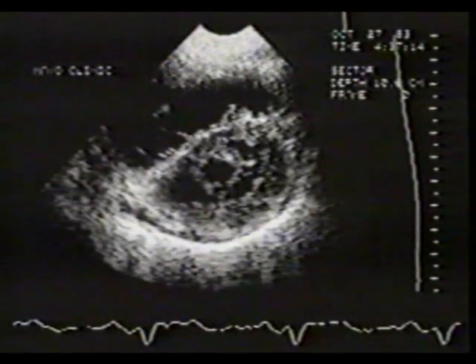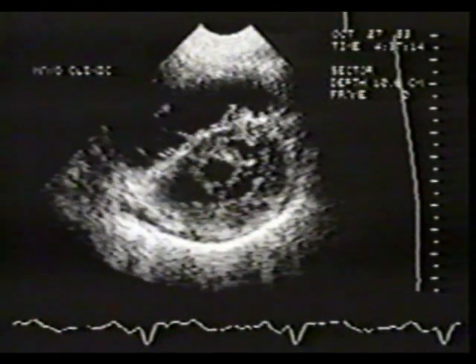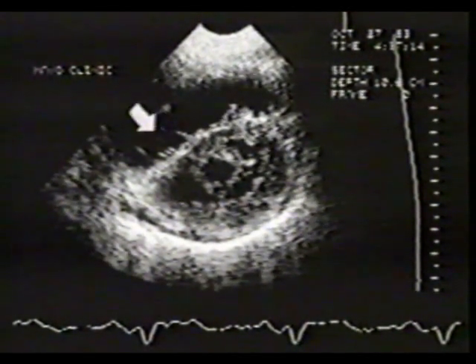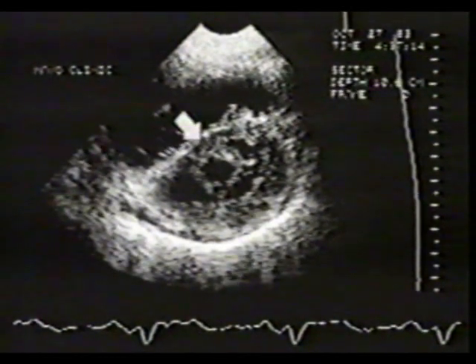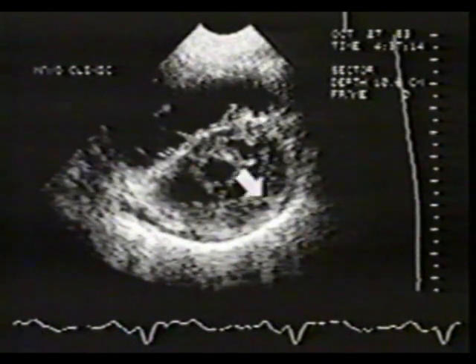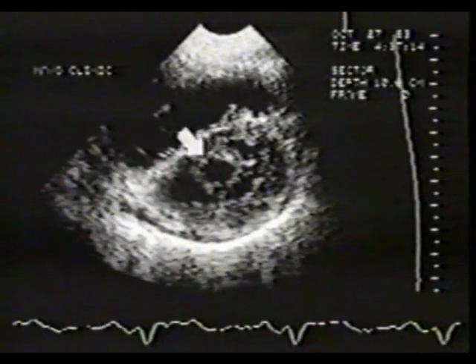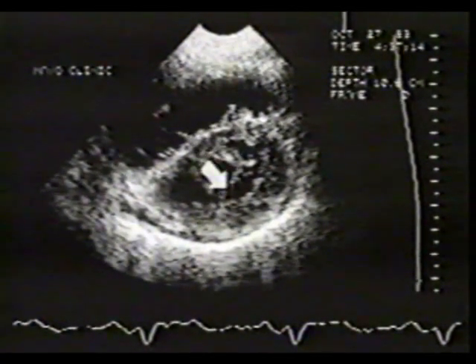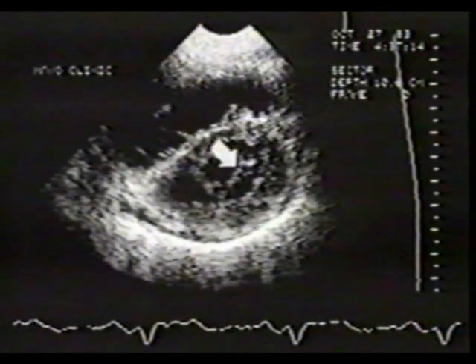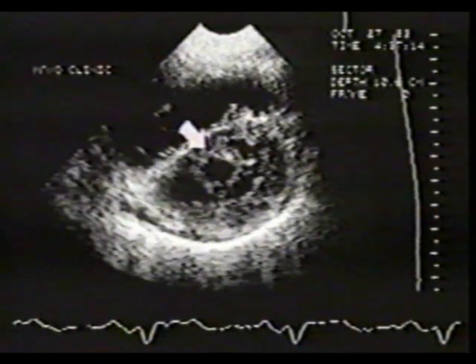This can be directly visualized by 2D echo, as illustrated by this diastolic short-axis still frame from a patient with mitral stenosis. The dilated right ventricle and the flattening of the ventricular septum are indirect signs of pulmonary hypertension. The left ventricle and mitral valve both appear in short axis. Note the thickened mitral leaflets. Fusion of the anterolateral and posteromedial commissures has resulted in a severely restrictive orifice, which measured 0.8 square centimeters.